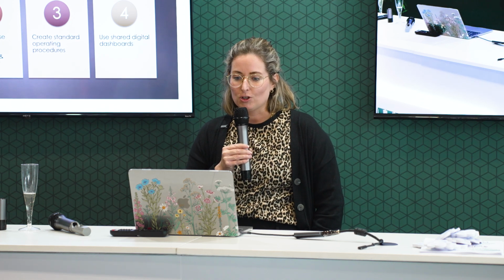You can set that nurse clinic up and start to build that bond and that relationship with the owner, which is something that's very important with our diabetic patients who are going to be often coming in and out of the clinic and wanting ongoing advice and support. Again, write it all down in a standard operating procedure so you've got a fixed way of doing it and everyone's doing it the same way. And then you can look to use these shared digital dashboards, as we said, as a team to access that information and then make decisions for our patients together.